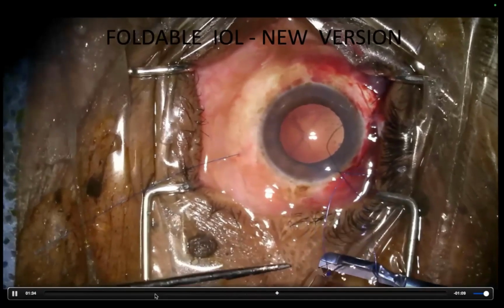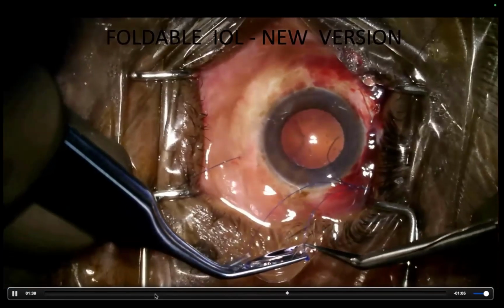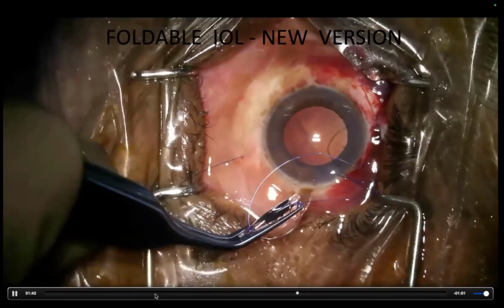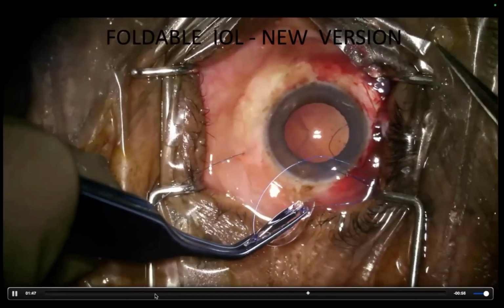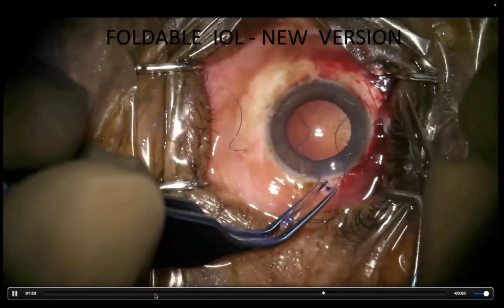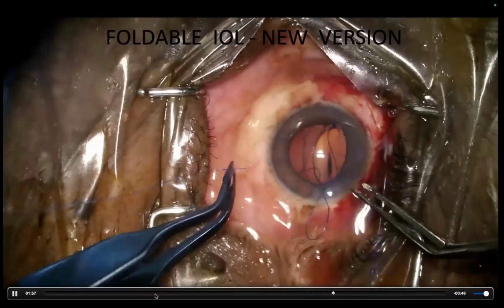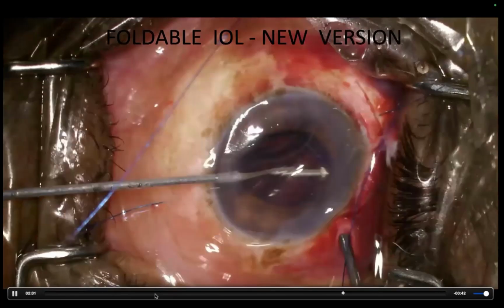So this is the folder forceps with which you fold the intraocular lens. So this is what I did initially, because the haptics have no role. They are positioned very posteriorly. People were asking if the sharp edges will damage the iris. So we are positioning it behind the ciliary body. You are going to be really, really far away from the iris, so you don't have to worry about it. So with the folder, you fold the intraocular lens, push it inside the eye.